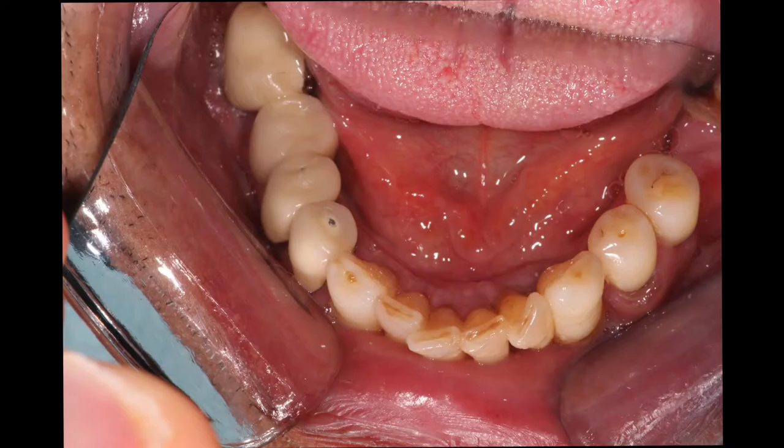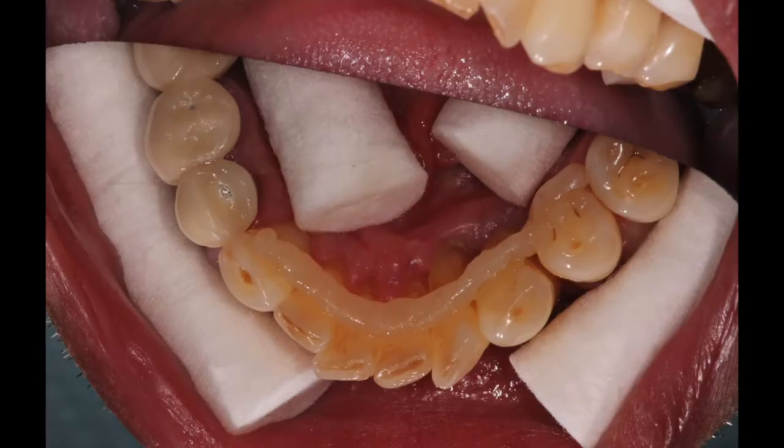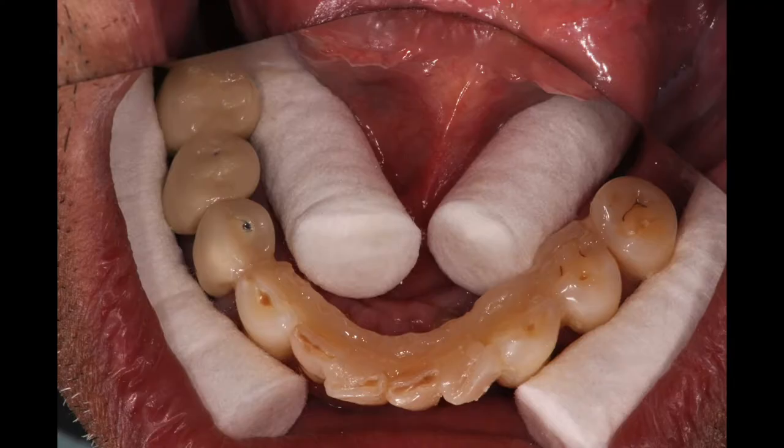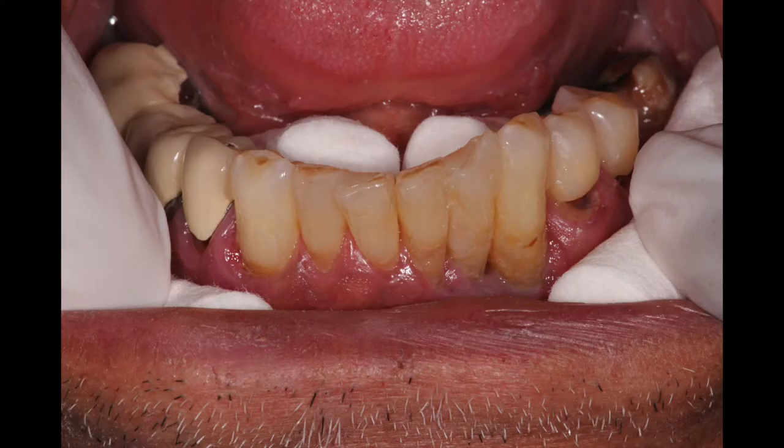In preparation for this case, we decided to actually place a bit of composite along the lingual in order to keep the teeth still while we're taking our preliminary impression, but also to make room for a reinforcing wire that we're going to use on his temporary. You can see the composite is actually in place, and we also added some composite to the incisal edges just to make them look aesthetically better.